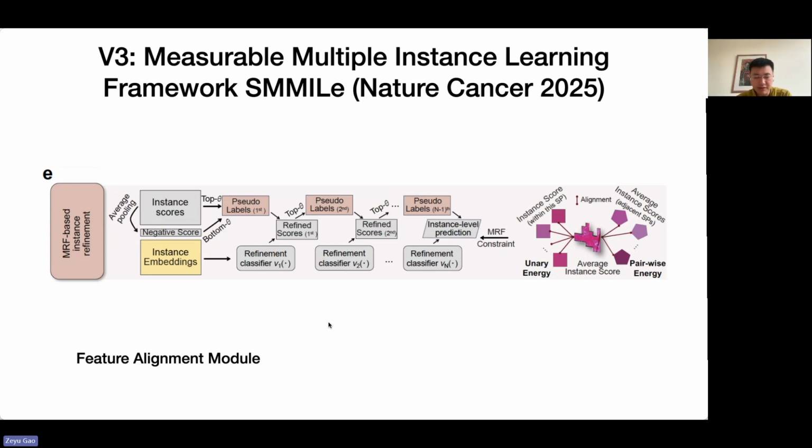If you set it to 0.5, it will give you an attention map. But if you set 0.3, it may recall more regions, but it will also recall more false alarms, right? We didn't want to set the threshold for each slide based on our naked eyes. We want to have a unified threshold for all the slides within our dataset, or within the whole training domain. So we have this Markov field-based instance refinement framework because we have the attention scores from the previous modules.